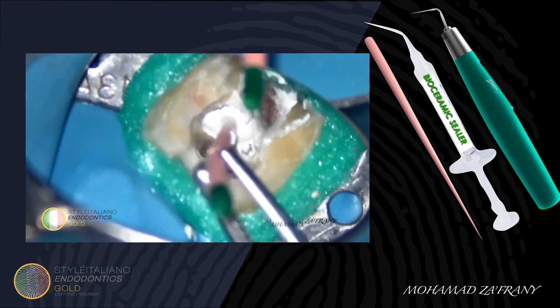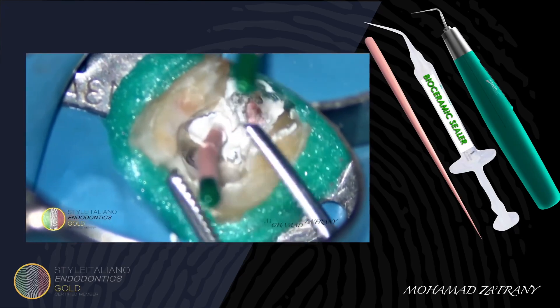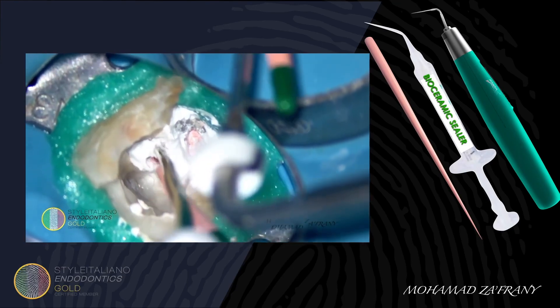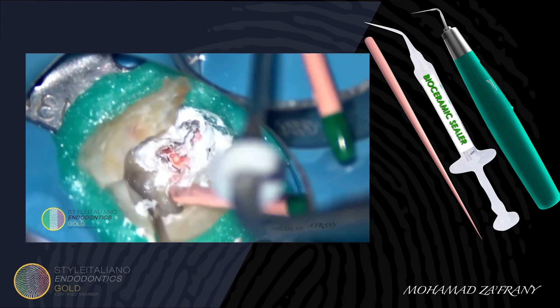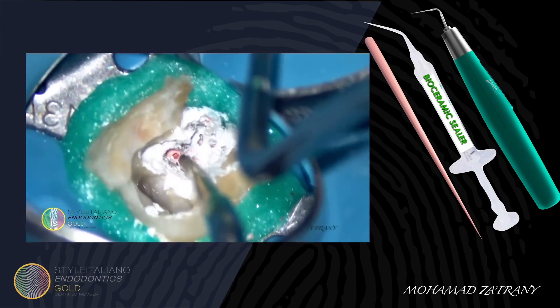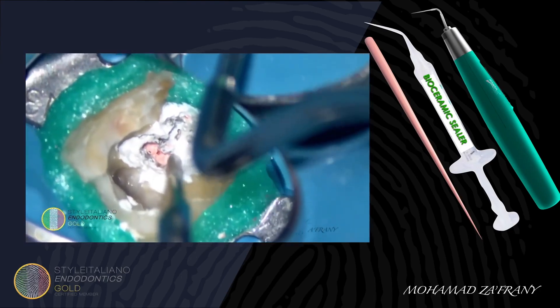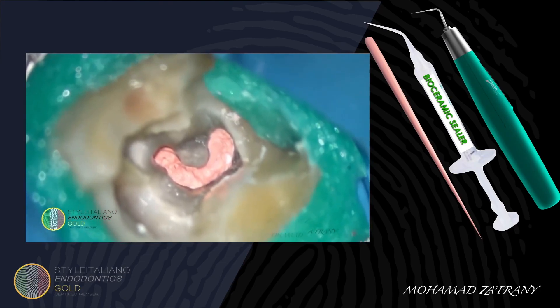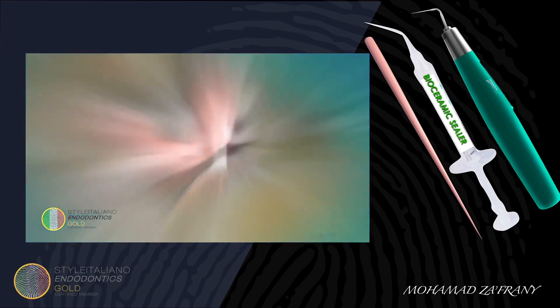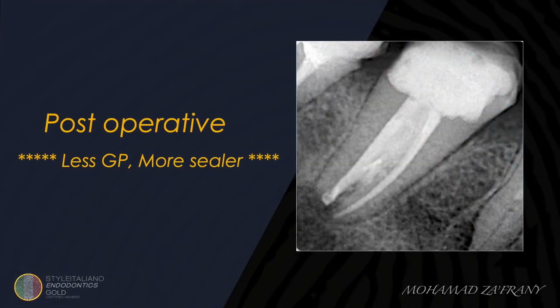Master cone placed in the mesial canal, then cutting the master cone at the orifice level. Compaction using a suitable plugger. Here is the case after completing obturation — you can see the nicely filled C-shaped canal. The main canals and the isthmus are all filled, thanks to the passive hydraulic condensation using bioceramic sealer. This is what we call 3D cleaning and 3D obturation.